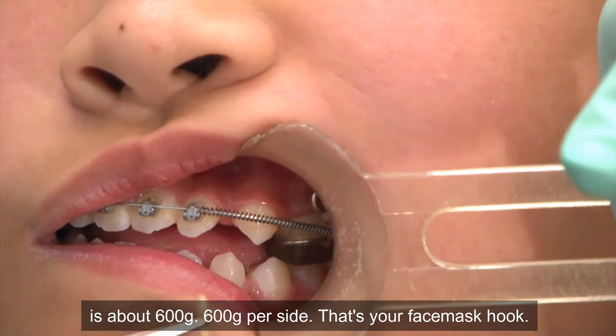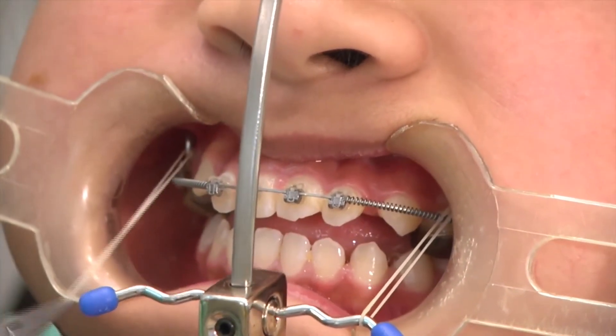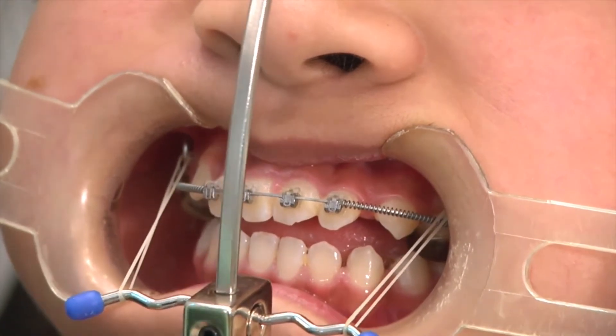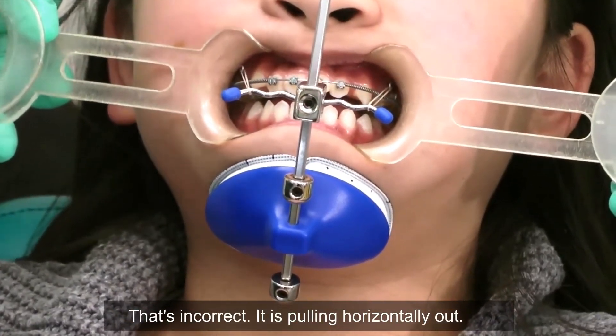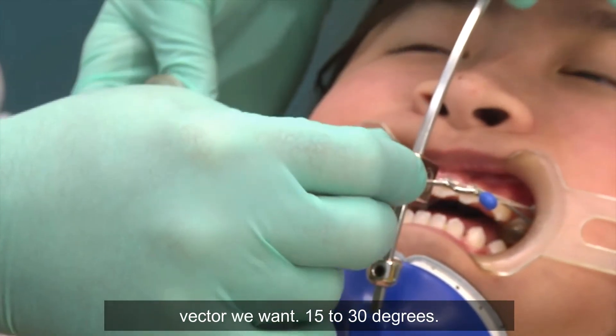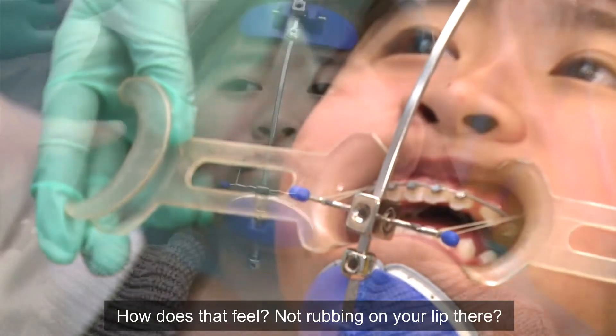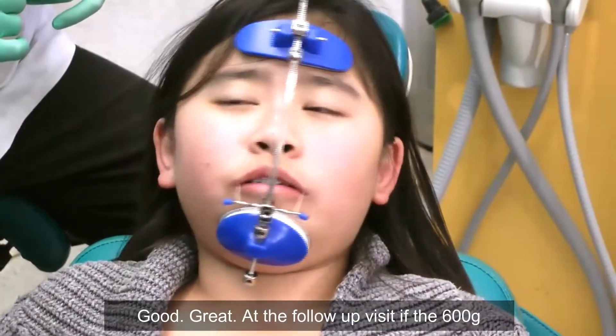That's your face mask hook — that's incorrect, it's pulling horizontally out. So we're going to adjust now to show you the vector we want: 15 to 30 degrees. How's that feel? Not rubbing on your lip there? Good? Great.